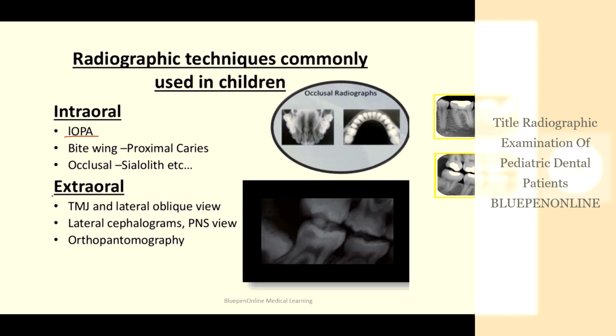Another radiographic technique is extraoral. So in case of extraoral technique, the film will be placed outside the mouth. So the commonly used extraoral techniques are TMJ and lateral oblique view, lateral cephalograms, PNS view, and orthopantomography or the OPG.